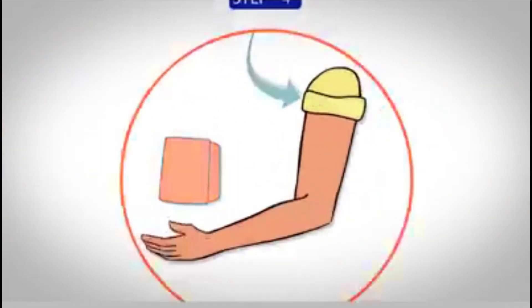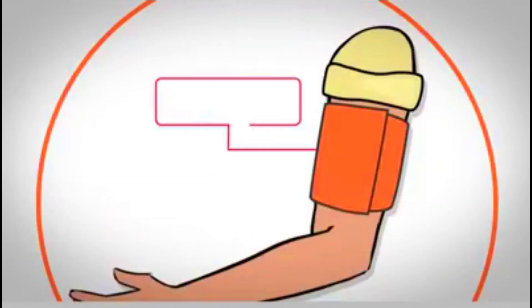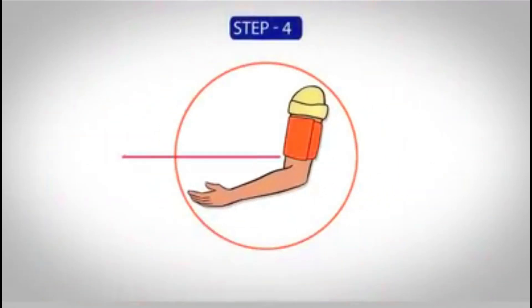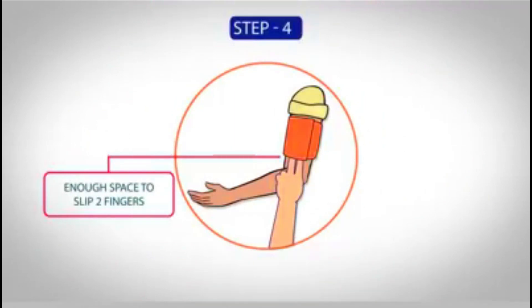The tubing should be centered correctly and the lower end of the cuff should be at least 2 cm above the elbow. The cuff should be neither too tight nor too loose. There should be enough space to slip two fingers underneath it.